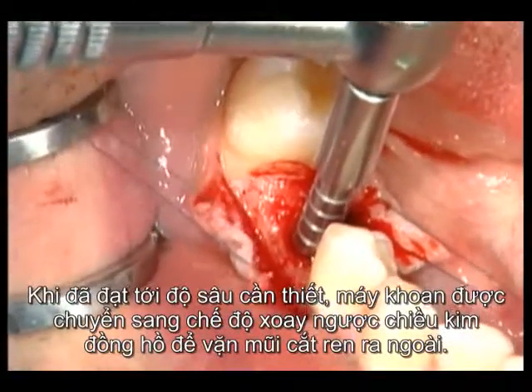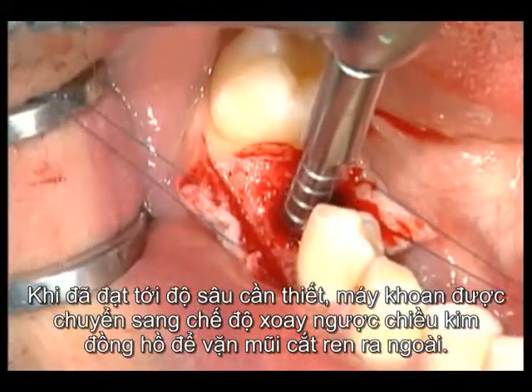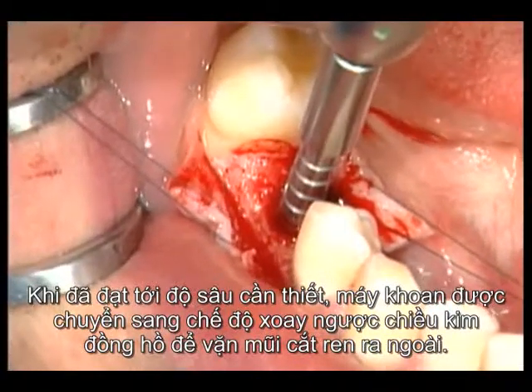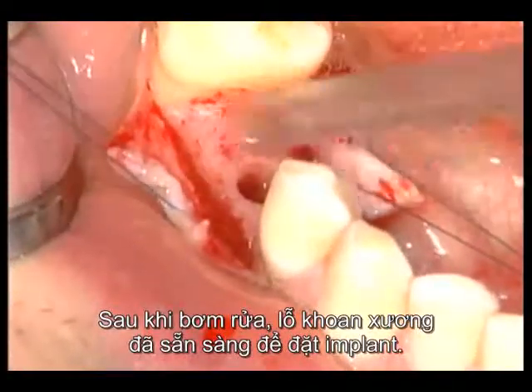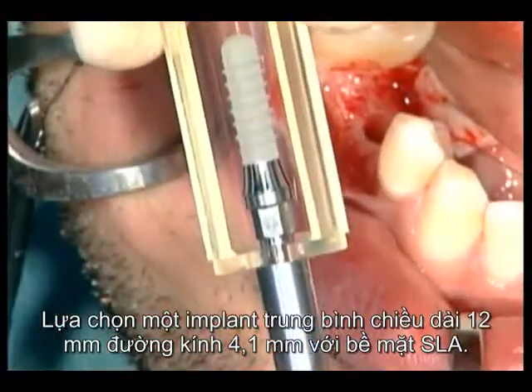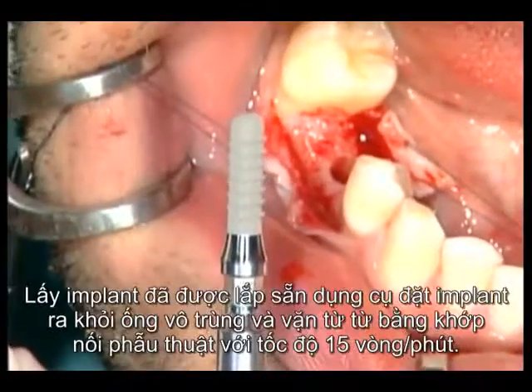When the correct level is reached, the drilling machine is switched to counterclockwise rotation to remove the tap. Following rinsing, the site is ready for implant placement. A 12 millimeter standard screw implant of 4.1 millimeter diameter with an SLA surface is selected.